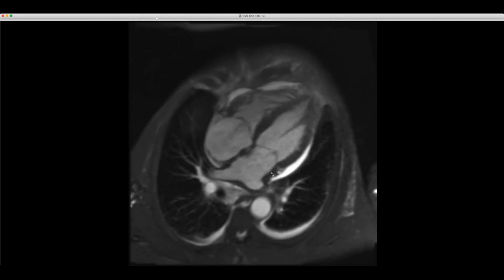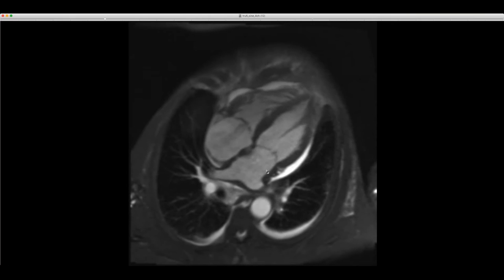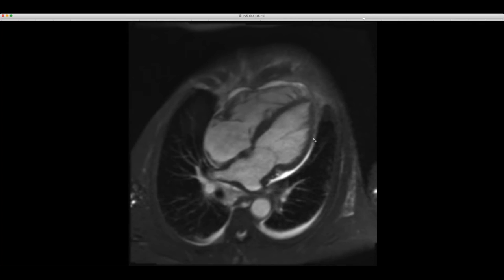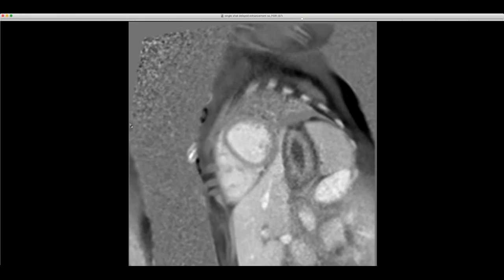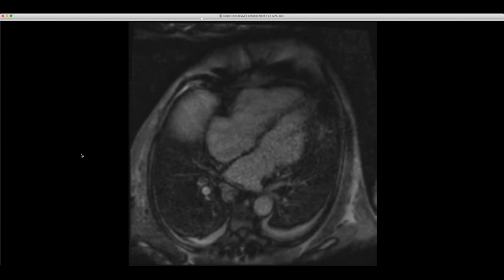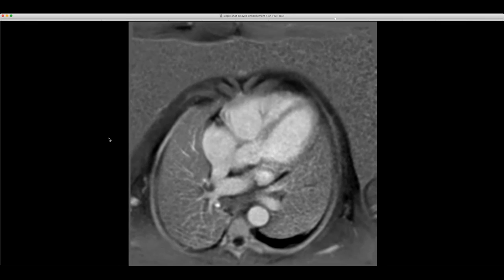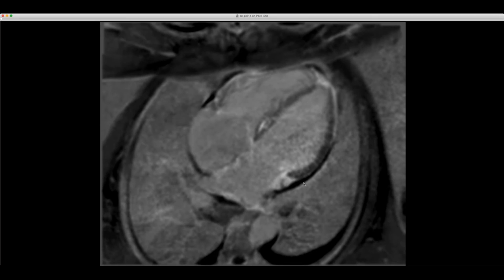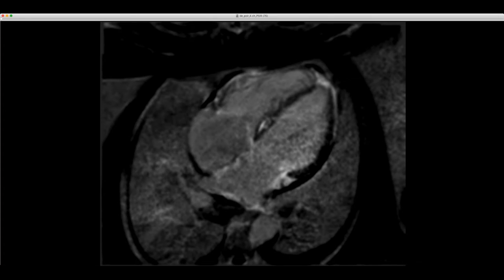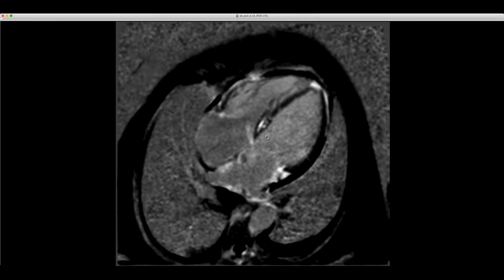The left atrium is not moving very well at all. You have some tricuspid insufficiency here, but look at that dramatic hypokinesis of the left atrium. The left ventricle is not moving very well either. On the delayed enhancement images, you can see pretty dramatic enhancement of the left atrium along that area of thickening, and a little bit of basal septal enhancement of the left ventricle as well. Now I'll give you the history — this is a patient with known amyloid, apparently on treatment.